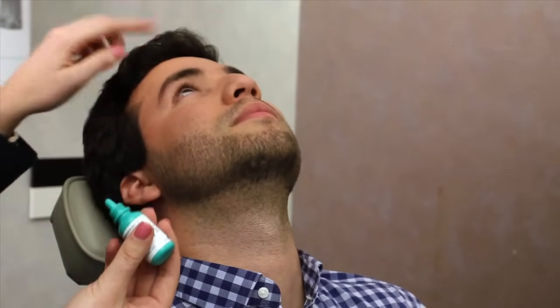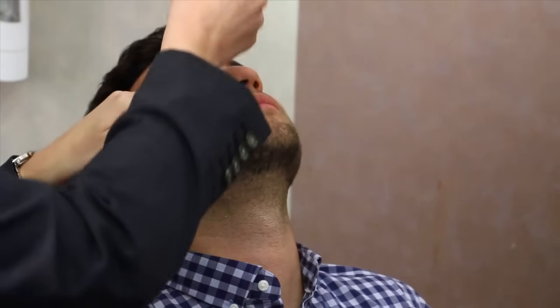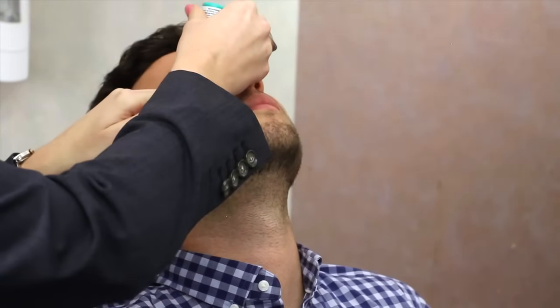Look up and with two fingers pull down gently on your lower eyelid. Squeeze the bottle and instill one eye drop. Close your eyes and gently wipe away the excess with a clean tissue.